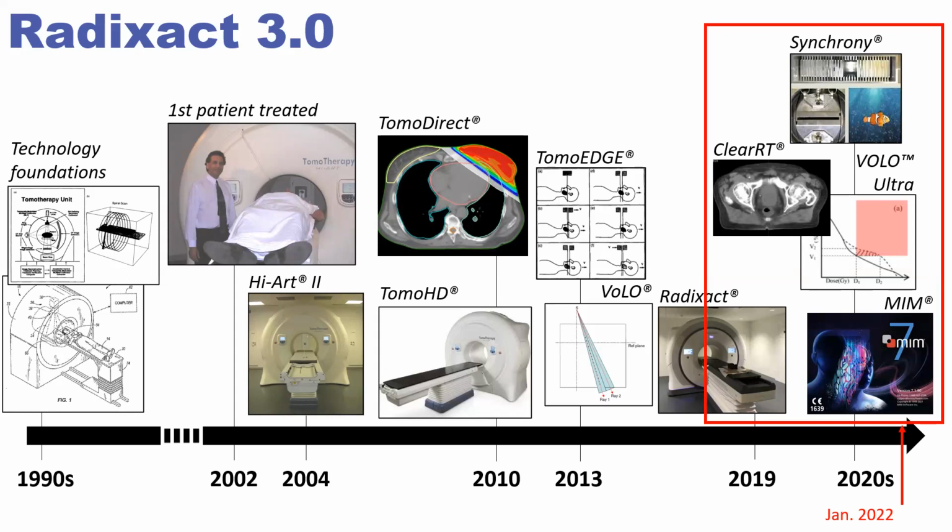And the big one, let's say, was January 2022. So about a year and a half ago, a lot of these additions came on. The big one here that you'll see in a lot of my slides, I have ClearRT. That's the marketing term for KVCT on the machine.